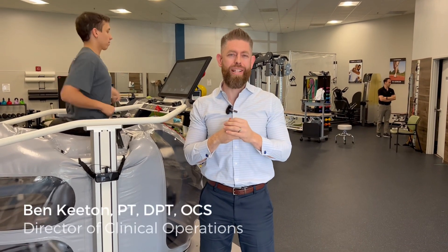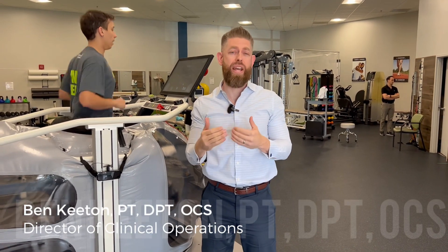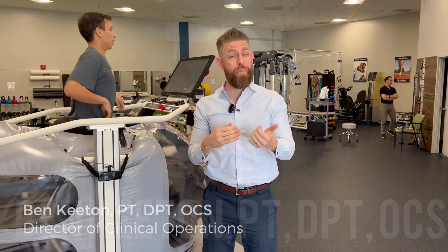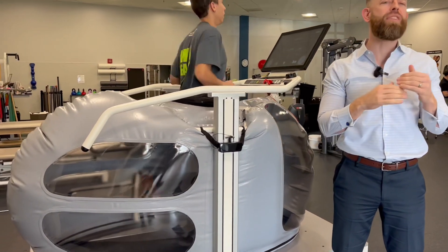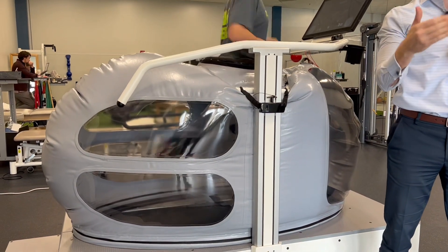The Boost Microgravity Treadmill allows you to de-load up to 80% of your body weight, reducing pain, helping to rehabilitate lower body injuries, and helping to increase distance without the wear and tear.